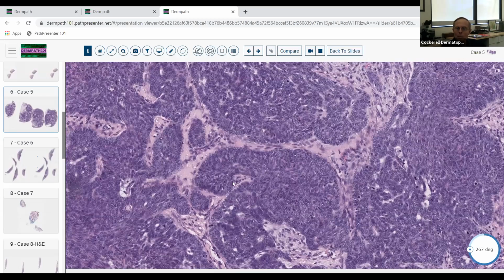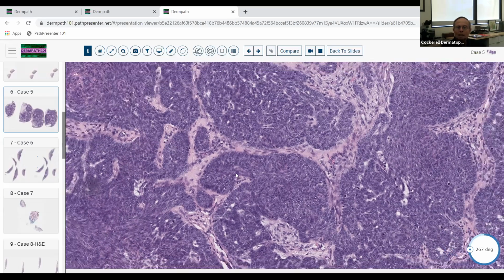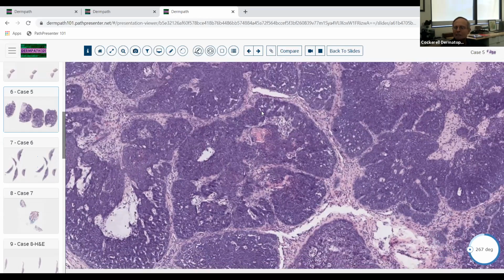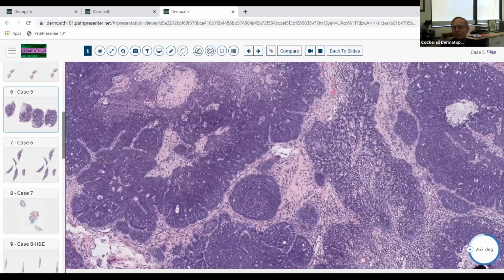And these are some little papillary mesenchymal bodies. Here's a little hair papilla, and it's forming a miniaturized follicle here. So again, I wouldn't really think this is a classic basal cell carcinoma. To me, this is more of a trichoblastic lesion, and maybe we would treat it like a basal cell carcinoma.